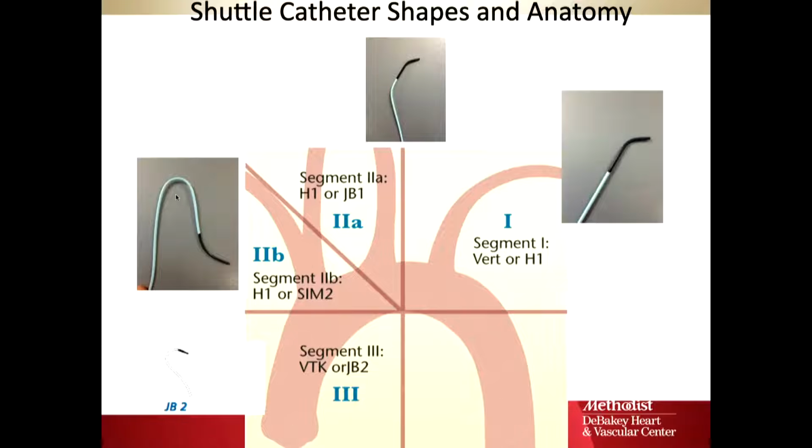If you have a reverse curve catheter, then this curve here is sitting down inside the ascending aorta, and the tip is coming backwards, and you pull backwards. Most of the time, to engage these origins, you're advancing a catheter into them. With these, you're actually pulling it backwards, and as soon as you engage, you'll see that it flicks up inside the target blood vessel.